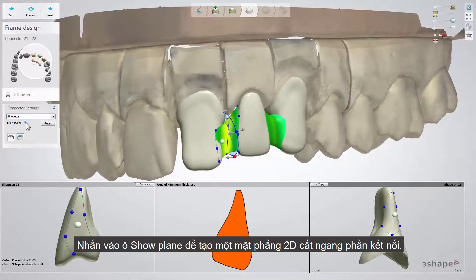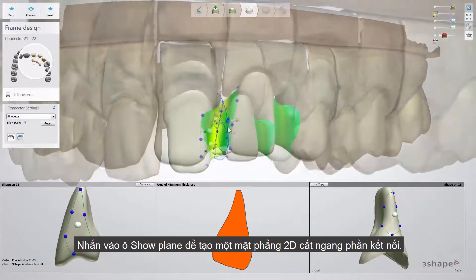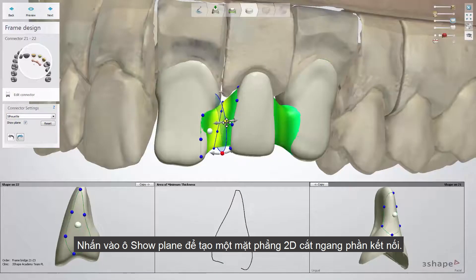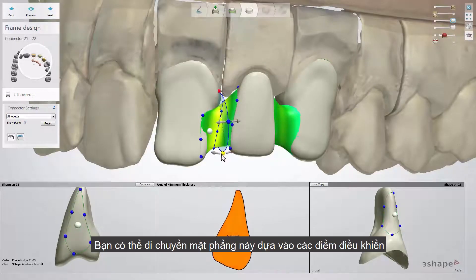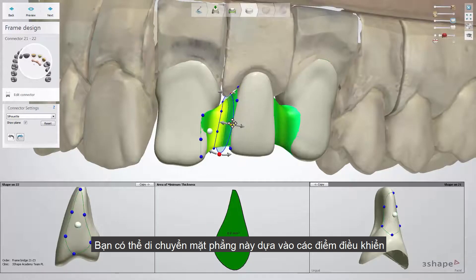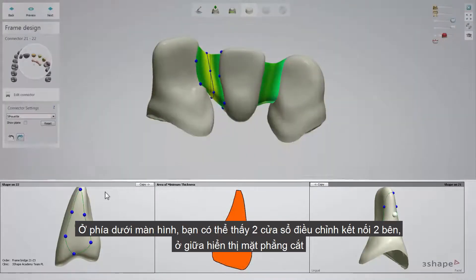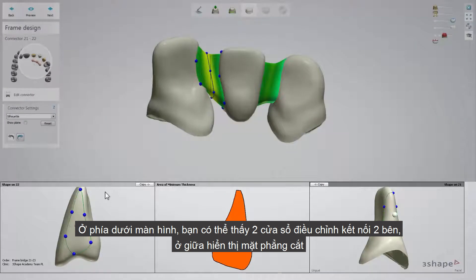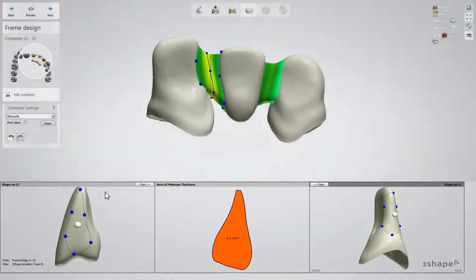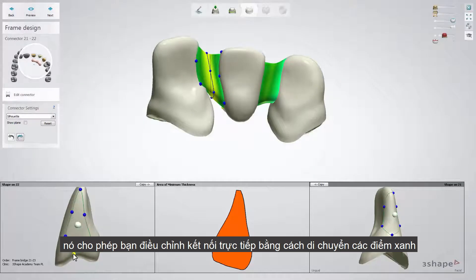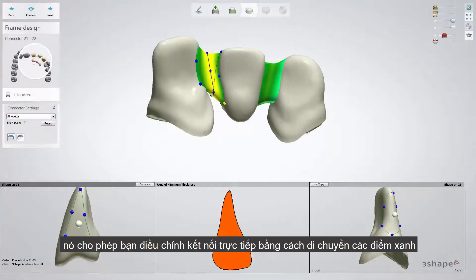Check the show plane checkbox and make the 2D cross-section appear on the screen. The position of that plane can be moved along the connector with the cross-section slider. At the bottom of the screen you can see two connector editing windows and in the middle of them a 2D cross-section preview window.